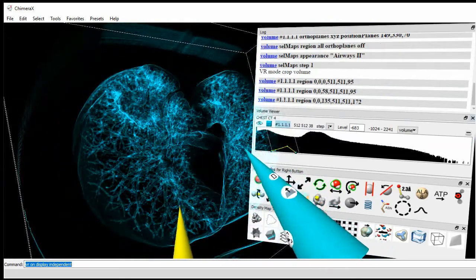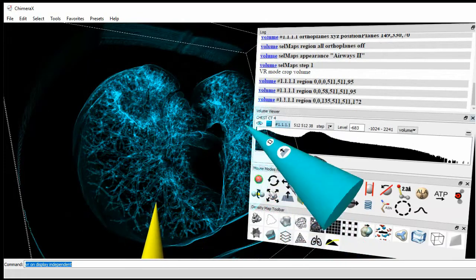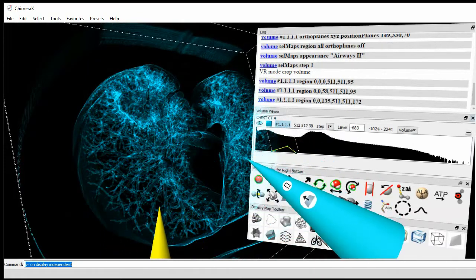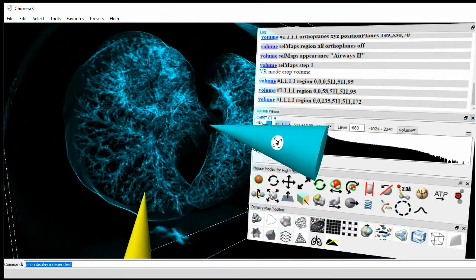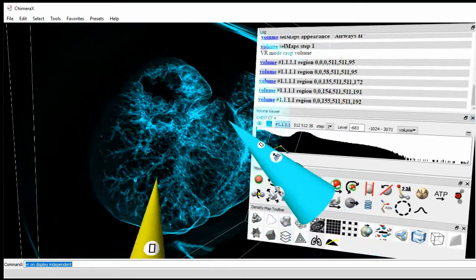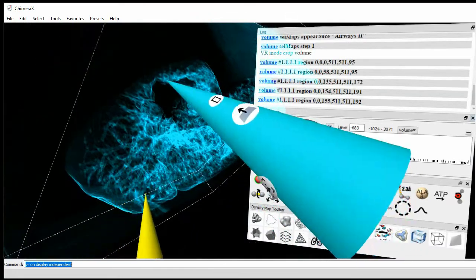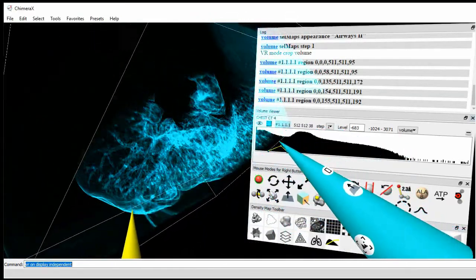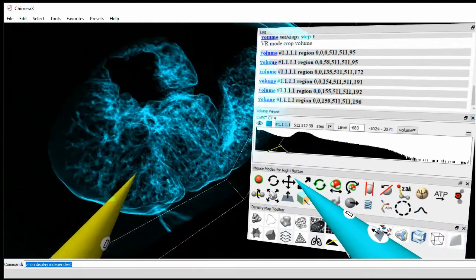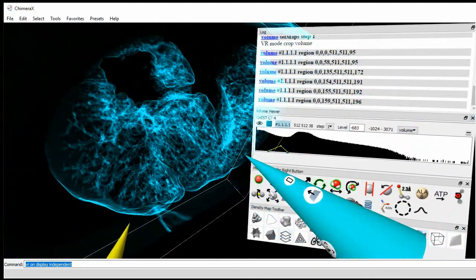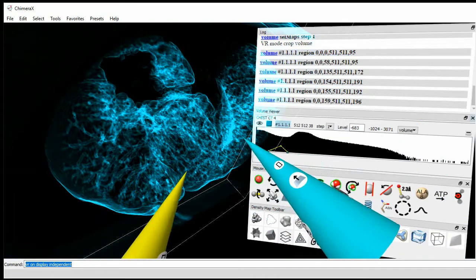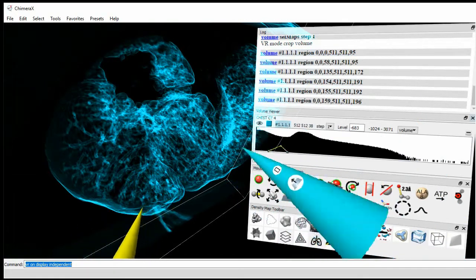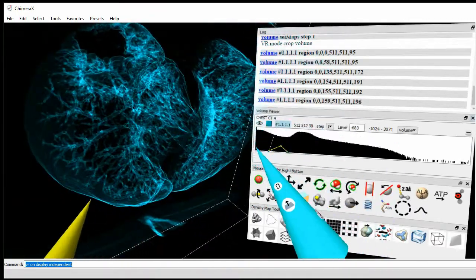I told you at the start this lung CT scan has a tumor. Let's take a look at what that looks like in the slab. Up here we see a void. The reason we see the void is because the tumor tissue is in a different range of intensity values than these airways of the lung.